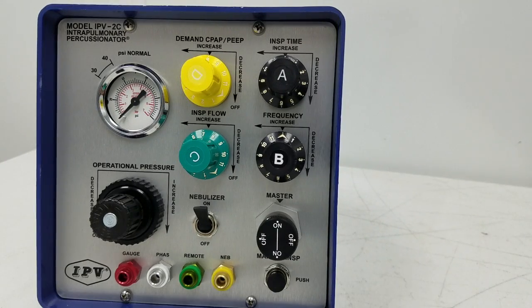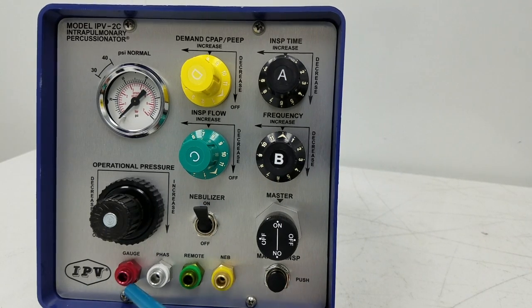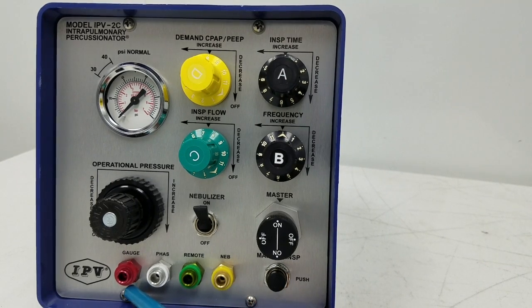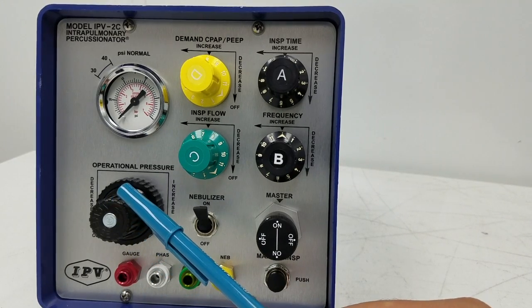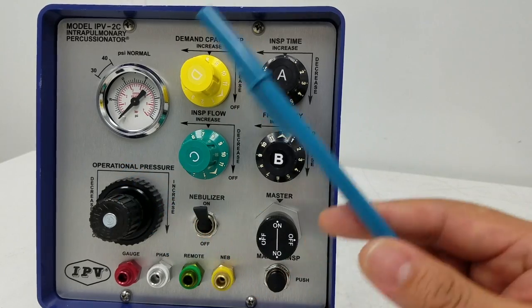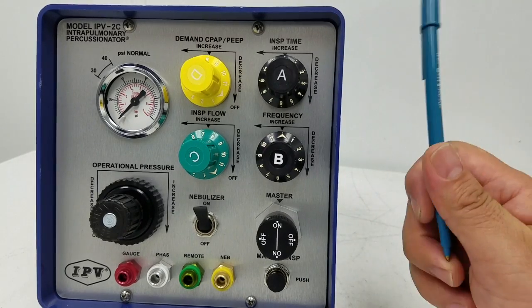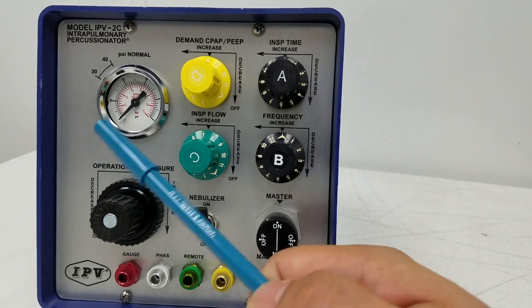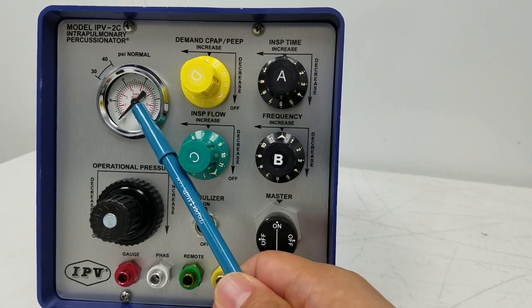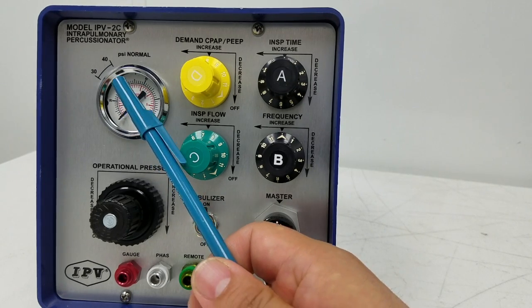What you'll notice, pretty standard with a lot of their devices, is they color-code where the connection for the circuit is going to go. You have your operational pressure here, which is the power source. When we connect this, this box requires a 50 psi source, so it is a pneumatic ventilator.